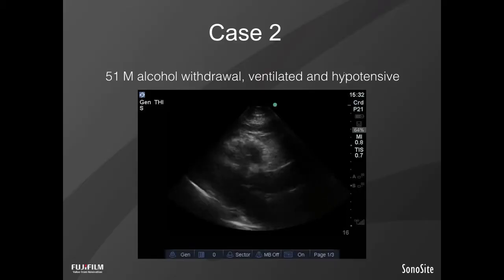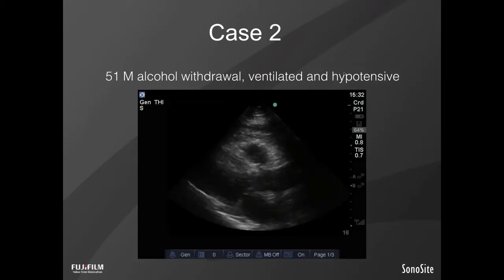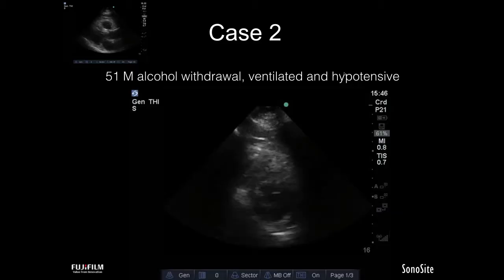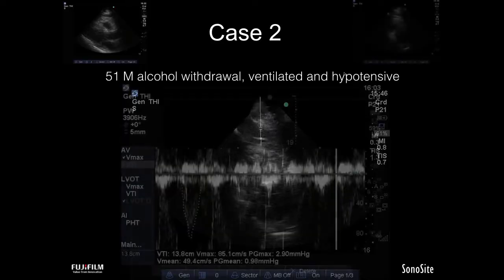The thickening and excursion of the 2 walls that are seen on this view of the LV look pretty good. No catastrophic effusion. We look to be shaping up okay. So not obviously either right or left ventricular failure from what we can see from either of these views. Now looking at the short axis, things look pretty good. Maybe a little bit hyperdynamic, but normal, not really a problem.